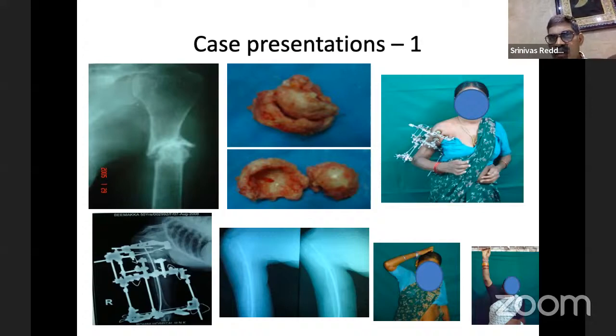Proximal half ring is applied with shank pins, and a wire is also applied proximally, and a middle full ring. And one more thing I do, in order to maintain the reduction, I pass a small Enders pin like that, so that our reduction becomes easier. It makes our job easier. After getting good reduction, it is better to have a small wire or a Rush pin or an Enders wire, which can be passed from distal to proximal from the lateral epicondyle. It's not that difficult, and it makes our job very easy.